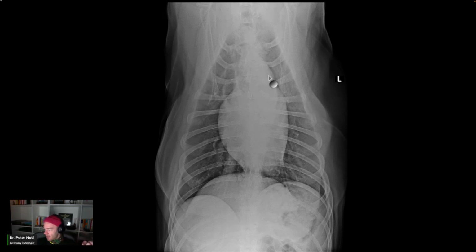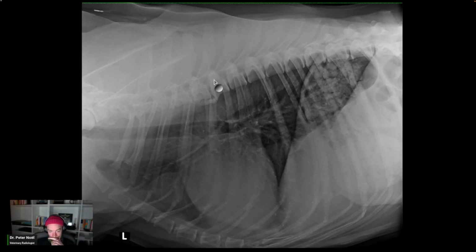And the thing is you can get widening of the cranial mediastinum secondary to fat, and we do have a fairly large deposition of subcutaneous fat. But I just think that if we were going to blame this on fat, in my experience, it's usually a little bit more uniform. It's just a little bit bulgy through here. And if it's fat, we can see some bulldog chest, but it usually is just this sort of straight shot of fat. So I don't really see it.